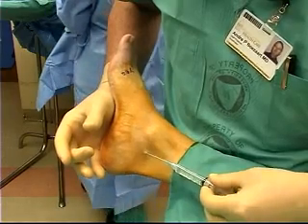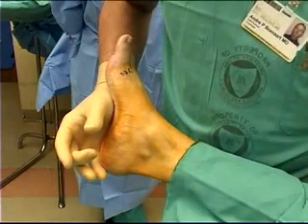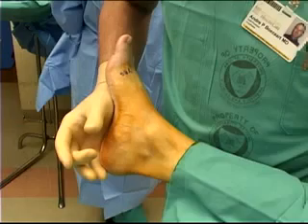With the patient in the supine position, the knee slightly flexed, and the foot externally rotated, the posterior tibial artery can usually be palpated behind the medial malleolus. The tibial nerve is just posterior to the artery. If the artery cannot be palpated, the surface landmark of the nerve is usually halfway between the medial malleolus and the Achilles tendon. The skin and subcutaneous tissue is infiltrated with 1 to 2% lidocaine, taking care not to penetrate the fascia with a fine needle at this stage.